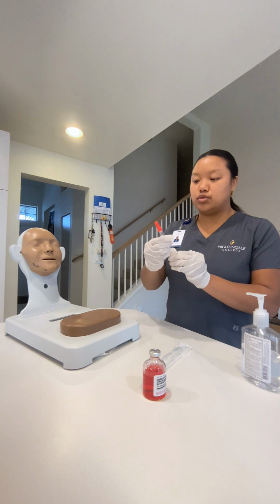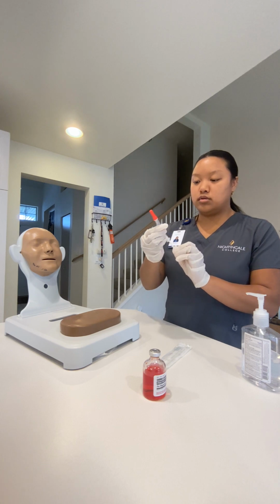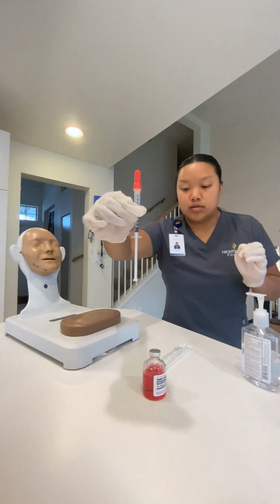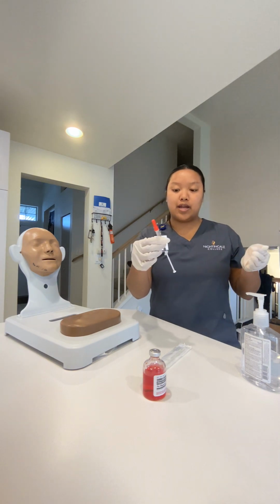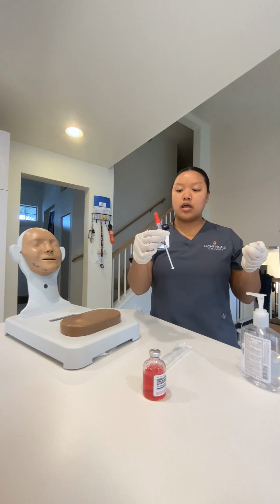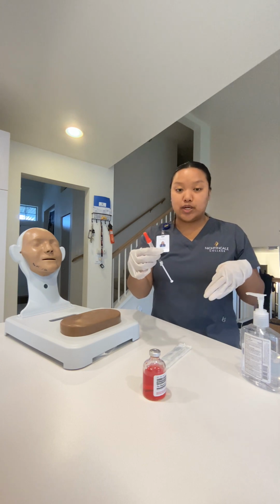And you want to get your air. This guy's hard to pull. So I have my 1 ml of air. So I'm gonna go ahead and open up my EHR and MAR again. I just wanna confirm that she's gonna get 1,000 units of heparin, and that 1,000 units of heparin is equivalent to 1 mL. So I'm gonna verify the 6 rights of medication.